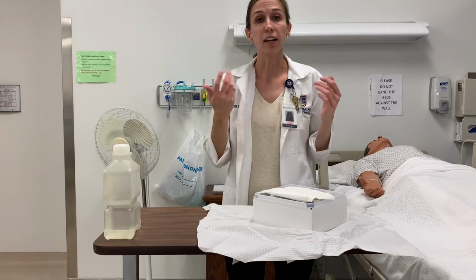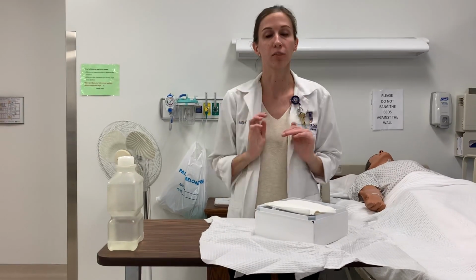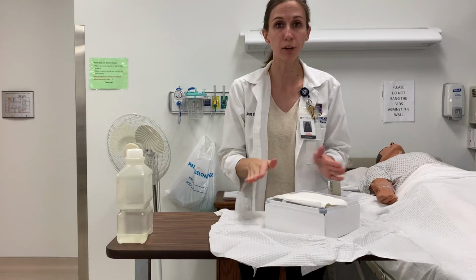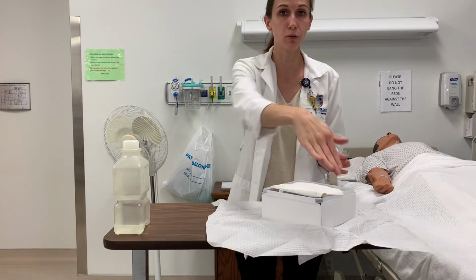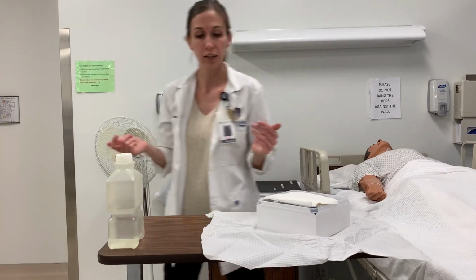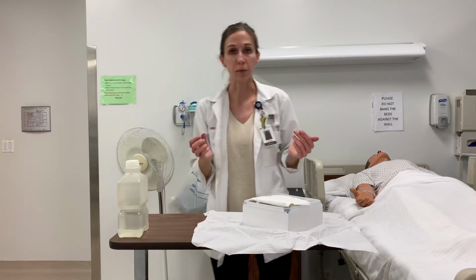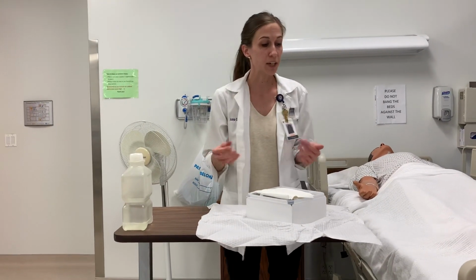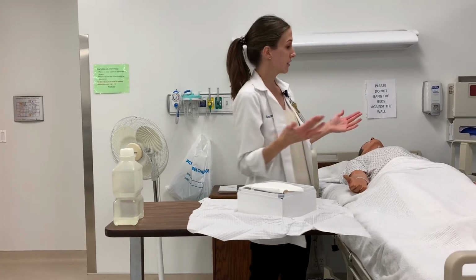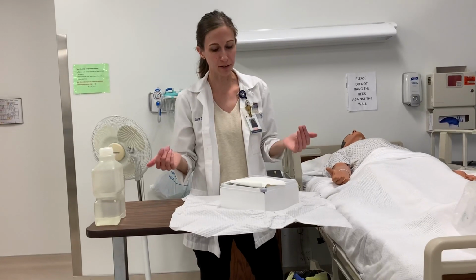But again, if I was grabbing anything from them and I'm grabbing that sterile item, I'd have to already have my sterile gloves on. So again, with sterile gloves, I can touch wherever I want within this kit, but I cannot cross over, okay? So if I did need to grab something on that other side, I'd have to come around and grab whatever items I needed, okay? So again, as I'm working with my client, you want to position yourself in a way so that I can still watch my client and watch my kit, okay, without turning my back.